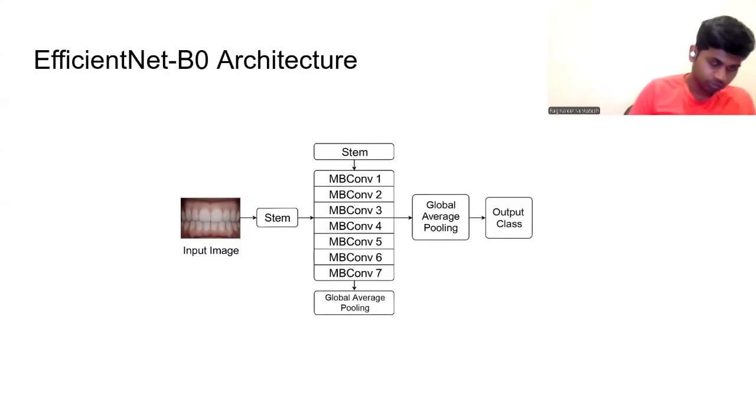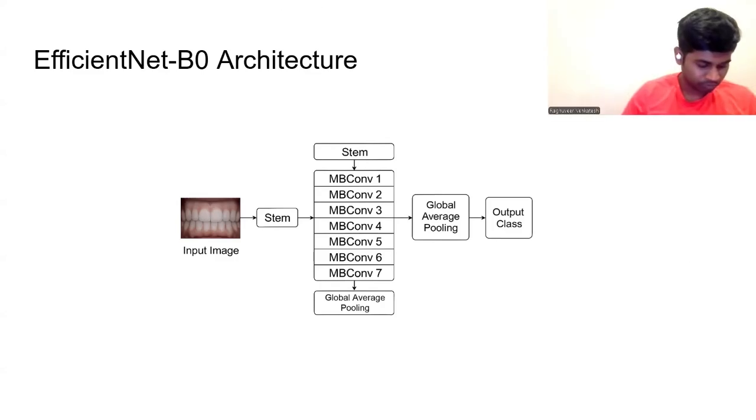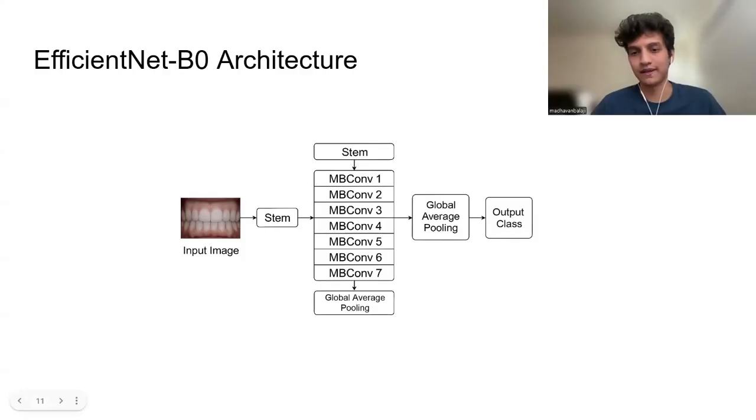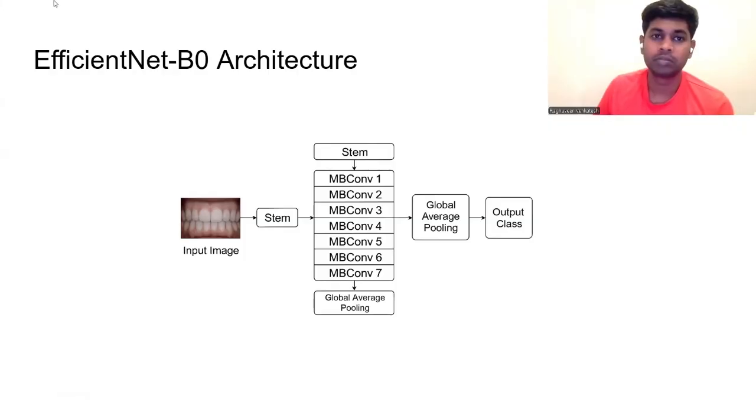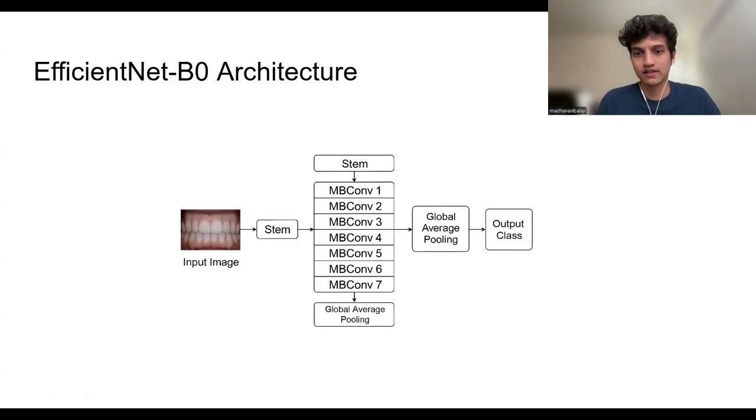After all the learning, the model compresses everything it understood using global average pooling. So instead of flattening everything like the older models we spoke about, it smartly summarizes the features, keeping things efficient and clean. Finally, it hands everything off to a fully connected layer that makes the prediction, classifying gingivitis, calculus, or healthy images. This is where the model makes its final call. Next slide, please.